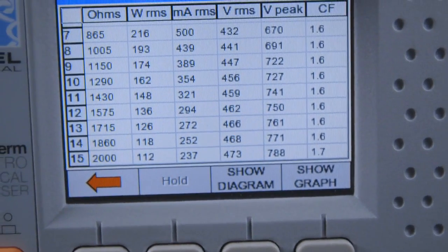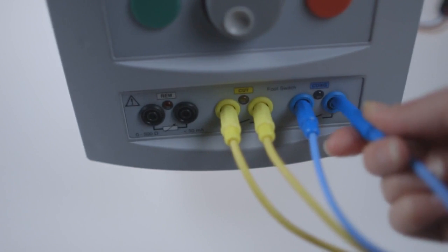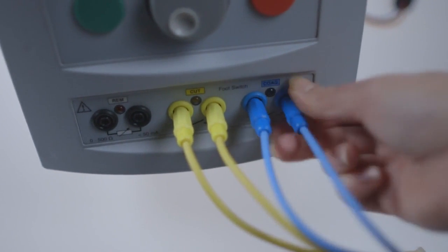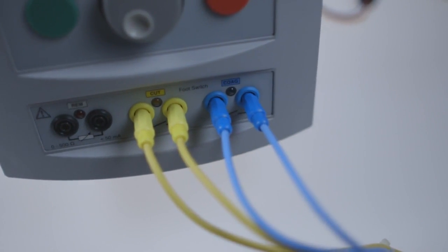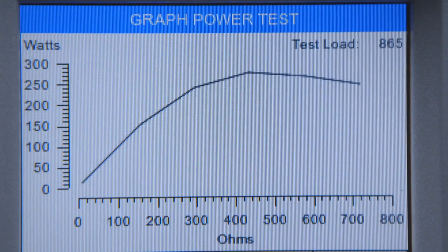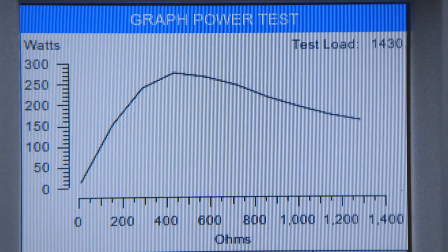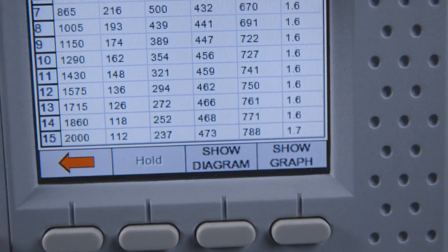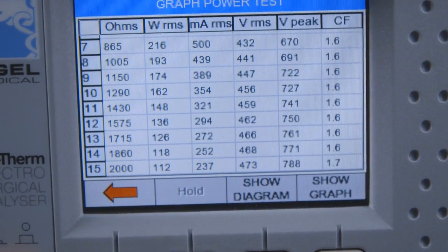Output power measurements are clearly displayed while the cut and coag foot pedal control automates the process. Graphical representations of power distribution curves can be easily switched to numerical data at the touch of a button.